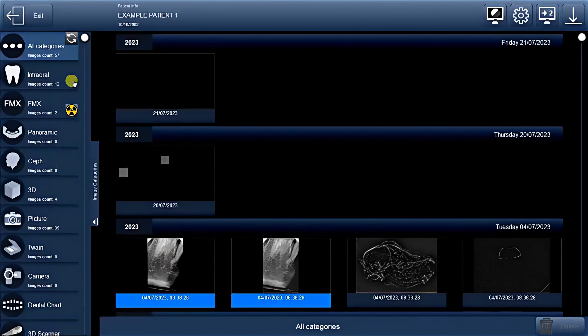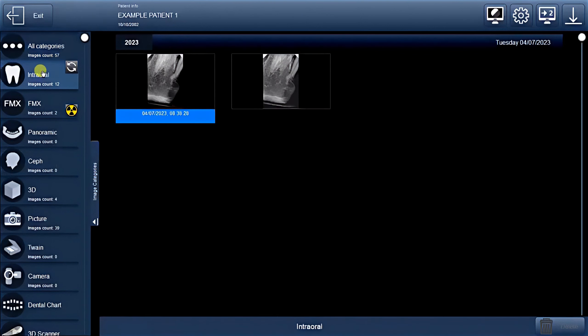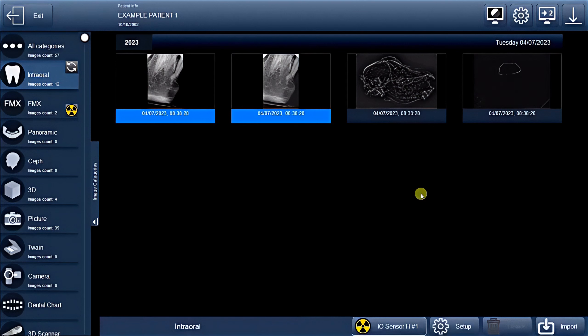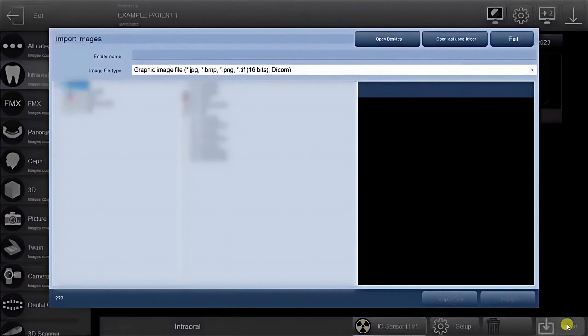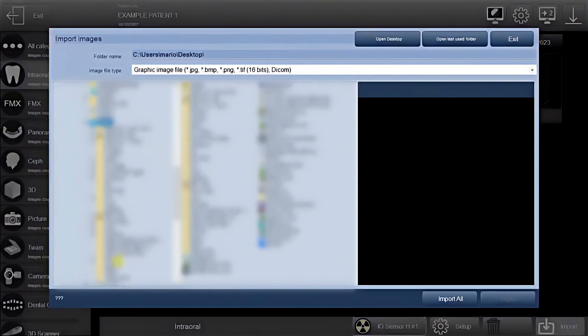To begin, head over to the intra-oral function. In the lower right corner, you'll find the Import button. By clicking on it, a new window will open, displaying all your folders and documents.